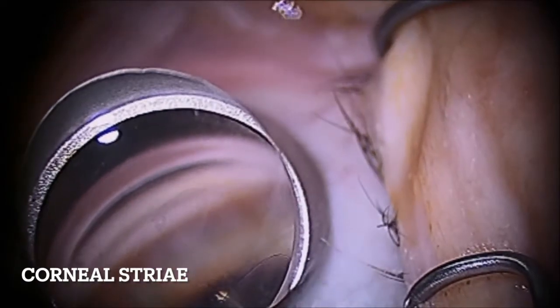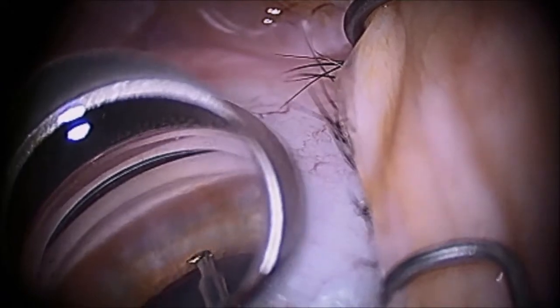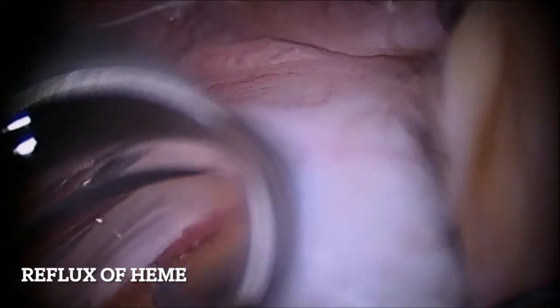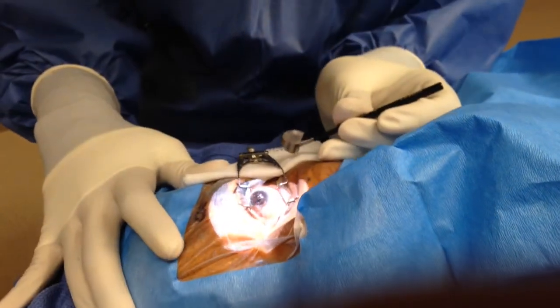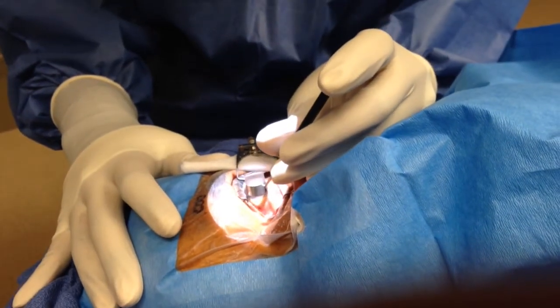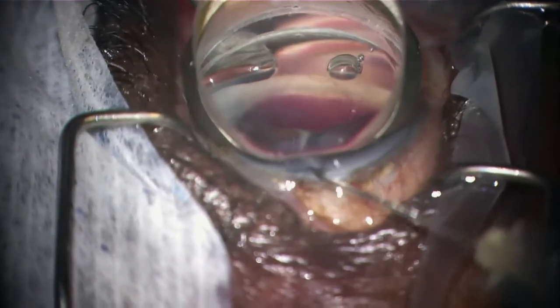A heavy hand can also result in loss of the viscoelastic that is pressurizing the anterior chamber, and with the egress of the viscoelastic out of the corneal wound, this can result in decreasing pressure, corneal folds, and a poor view. Loss of pressure can also result in reflux of heme if the trabecular meshwork has been unroofed or removed in any way. Conversely, applying too little pressure on the corneal surface or too little viscoelastic can lead to bubbles in the viscoelastic or air pockets that can also similarly obstruct your view.